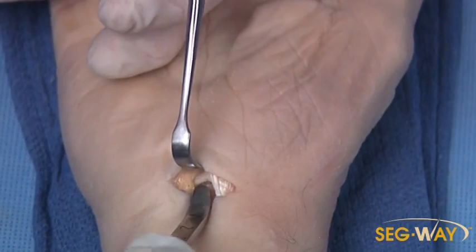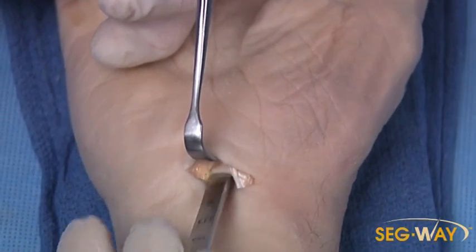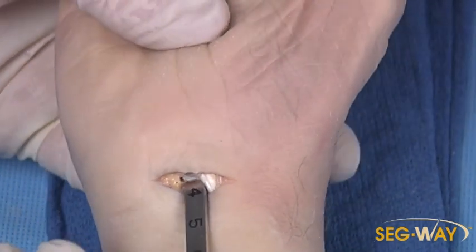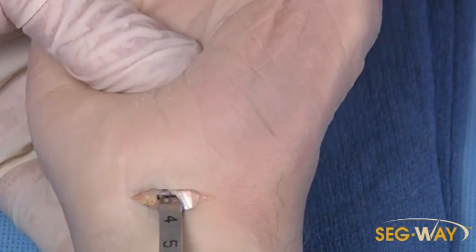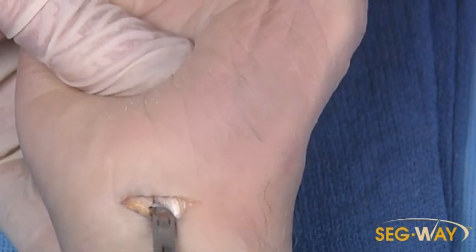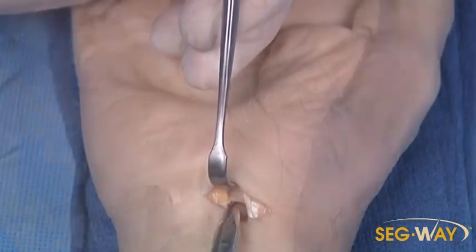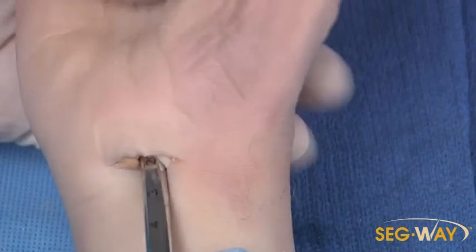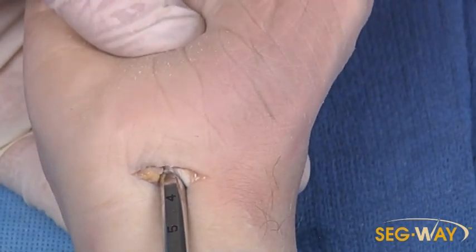Next step with the elevator, we're going to use the other end to scrape the synovium off the underside of the ligament, noting how far it goes into the edge at about three and a half centimeters, then with a back-and-forth scraping motion along the edge. Next step, use a series of dilators to dilate up the canal, again confirming about three and a half centimeters to the edge.